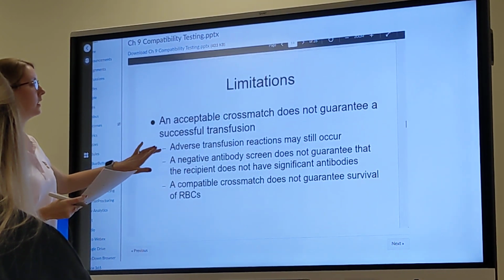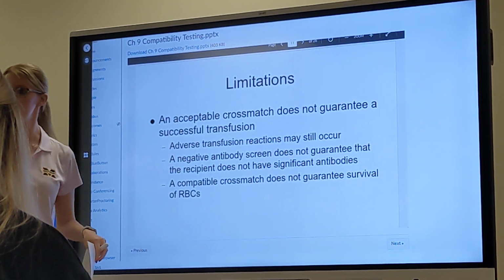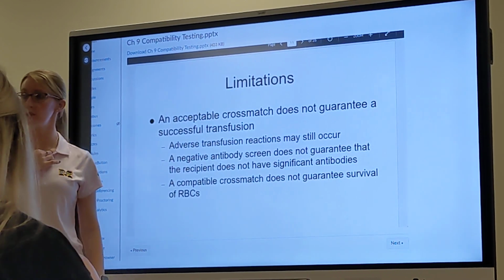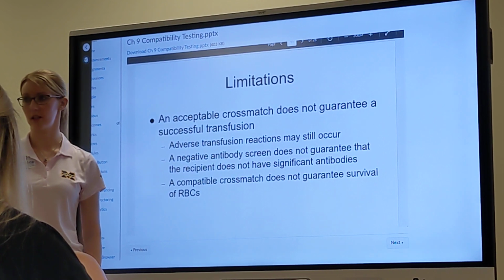It was very scary coming back from maternity leave, and they were doing computer cross matches, not doing any cross match. I like to see in the tube that my cross match was compatible, because then I knew. And here they were just scanning units and slapping a patient tag on there, like, here you go. The first time I did it, I was like, I don't like it, I don't like it.